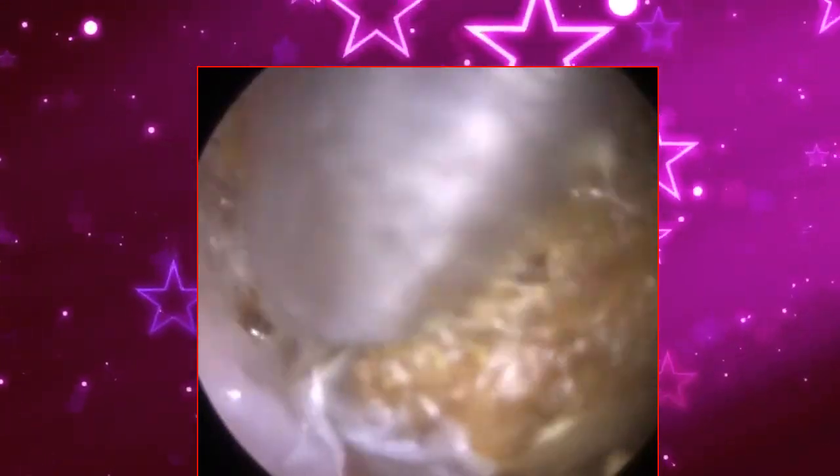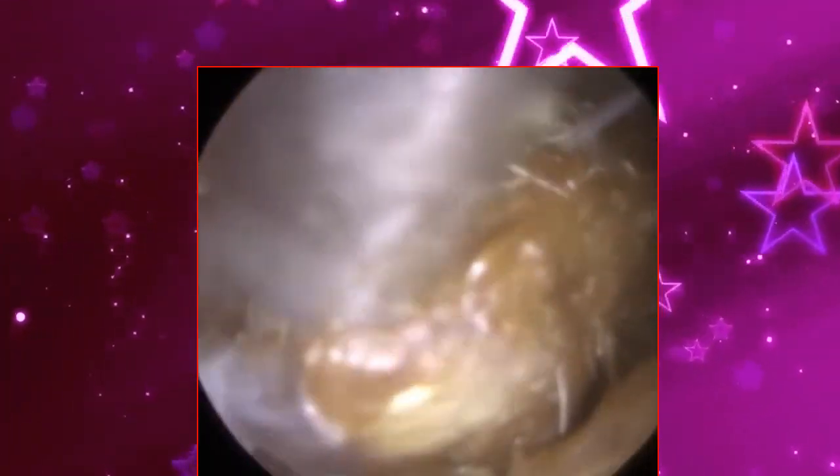This is right up against the patient's eardrum now. It's the last plug. It's trapped in the inferior recess, so there's a little basin near the eardrum where you can get wax trapped or dead skin or even fluid, water. So I'm just trying to lift this out of the trench, so I'm suctioning upwards, and then once I get out of the trench, I'm rolling it down and then out of the ear. See all those ribbons of skin.